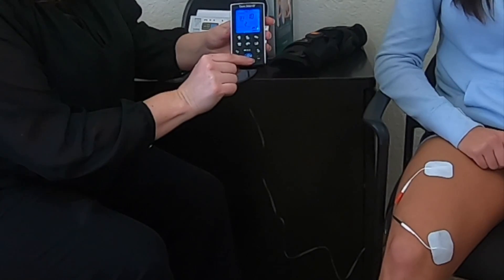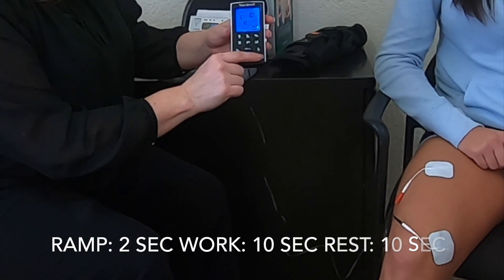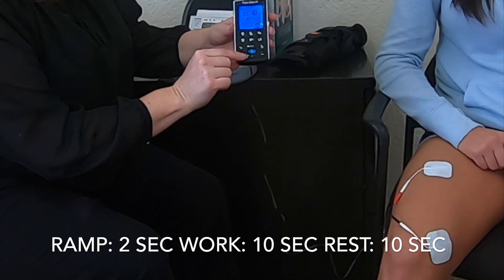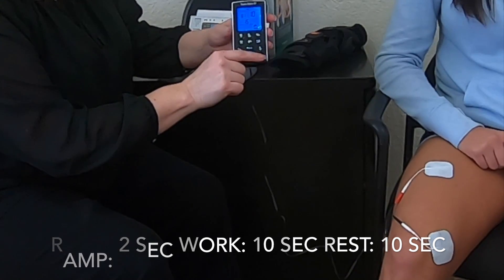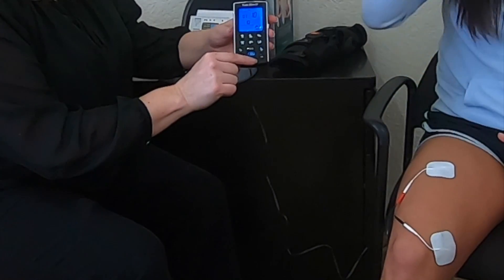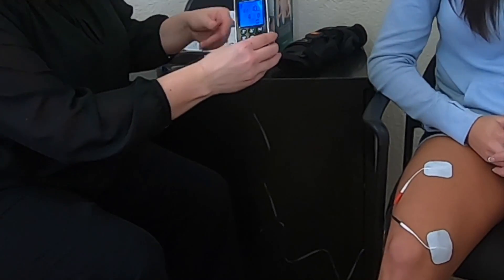This is the ramp time — two seconds — we'll leave that. Here is the work cycle, which we're going to lower from 12 seconds down to 10 seconds. Hit S again — this is the rest cycle, which we'll also take down to 10 seconds. So we're doing a work-rest cycle of 10 seconds on, 10 seconds off. Please refer to your therapist as to what they'd like you to do. Hit S again and now we're set.